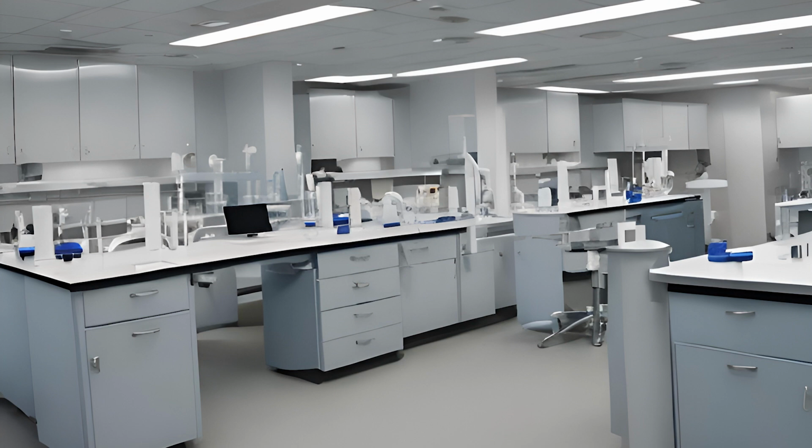Most of the time, your patients are going to have the prominent veins that you're looking for in their dominant arm. So if you want an easy way to go about this when you're learning the procedure, just draw blood from their dominant arm. Once you get better at it, I personally prefer to draw blood from someone's non-dominant arm so it is less inconvenient for that person.